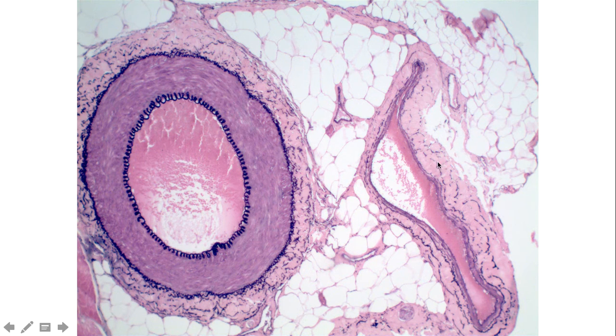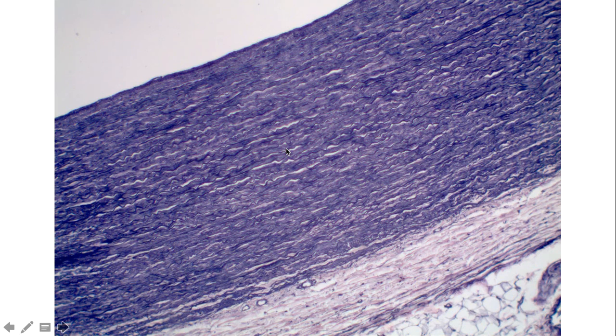They tend to have a thick tunica externa relative to media, whereas muscular arteries, they're going to have the relatively thick tunica media in relation to the externa. And as a muscular artery, it's going to have these very prominent elastic layers, the internal and the external elastic lamina. Whereas our third, the elastic arteries, they're going to have the elastic layers alternating throughout the entire tunica media. So again, this whole thing here is the tunica media, followed by the tunica externa.